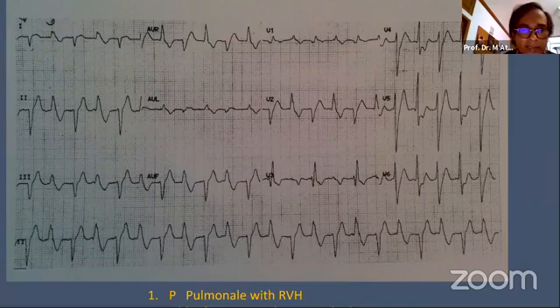And the next beat should be the ectopic beat. It follows all the criteria of the ectopic beat, that is the RBBB morphology. And another way is you just trace a line from V1.